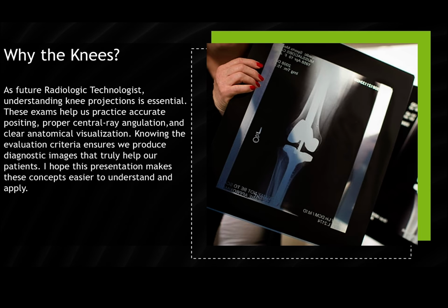So why the knee? As future radiologic technologists, mastering knee projections gives us a solid foundation in positioning accuracy, central ray angulation, and image evaluation. These exams teach us how to see rotation, to judge alignment, and how to correct mistakes before they repeat themselves. And most importantly, they help us serve our patients with confidence, clarity, and care. I hope this presentation helps these projections feel clearer, more approachable, and more purposeful.